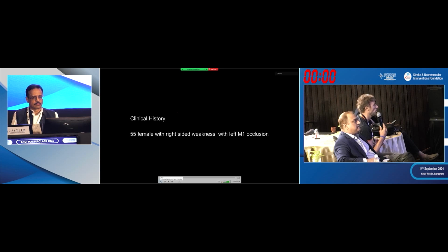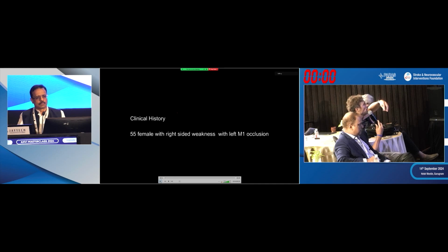So I advise you to be very gentle with the microcatheter, to rotate your wire while you are crossing the lesion, and if you are still stuck too long, it means you are in the false lumen, so you can remove and try again. There is a tip and trick that is good to cross them, which is to inflate the balloon guiding catheter and push a little bit of contrast, to let the contrast stagnate, because slowly you may see one part going in the false lumen and the other may show you the true lumen. So you just have to, even if you're under local, follow the stagnating contrast column into the true lumen.